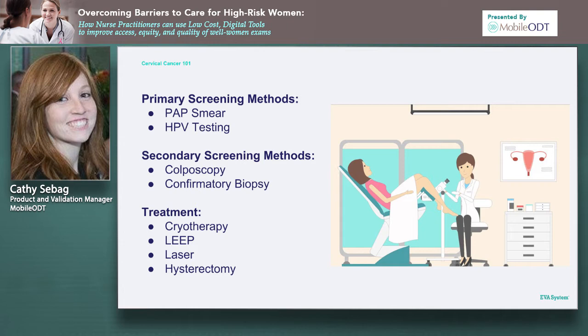Now, if women are found to have an abnormal primary screening, meaning they're HPV positive, or the Pap smear came back with some sort of presence of dysplasia, whether it's low grade or high grade, or cells of unknown significance, they really should be called back to see what's going on. That's when we start to do a visual exam called colposcopy. Colposcopy is done with a medical device called a colposcope. And like the first exam, a speculum is inserted. And the little picture on the right shows a provider just visually looking at the canal, inside the vaginal canal at the cervix in a very magnified way to see what types of lesions may be there.